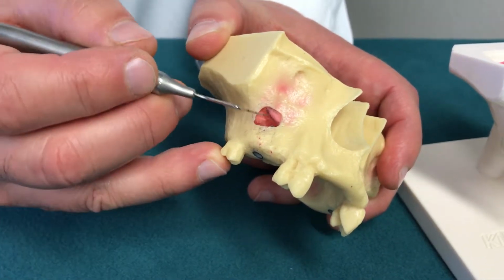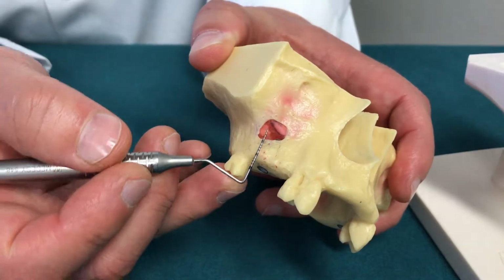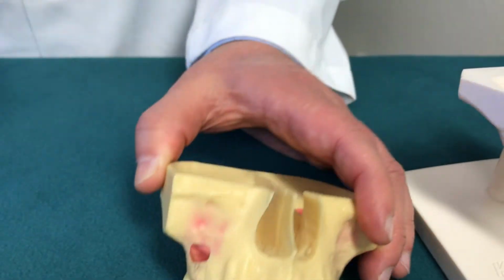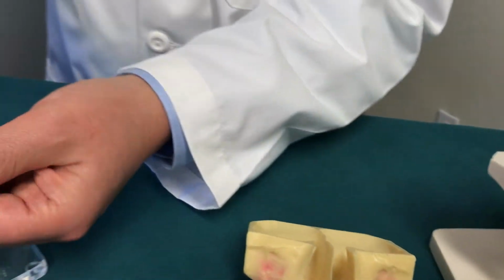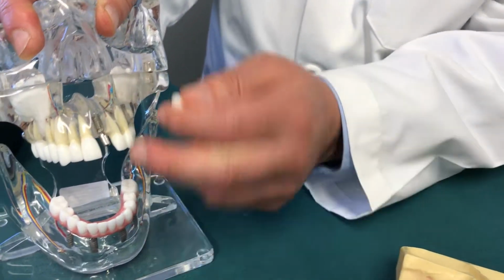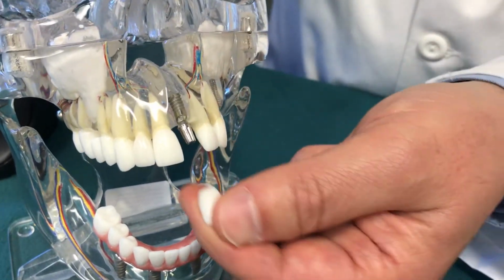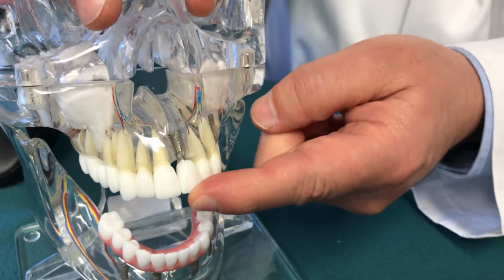And what happens is that this will regenerate. Now we have all of our implant within the bone. And after 5-6 months, we will put an abutment over this implant, and then we will put a crown over it.